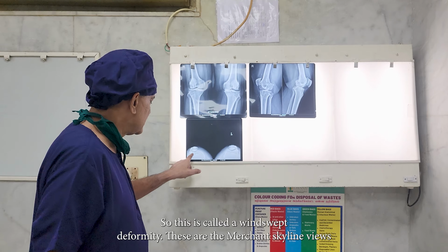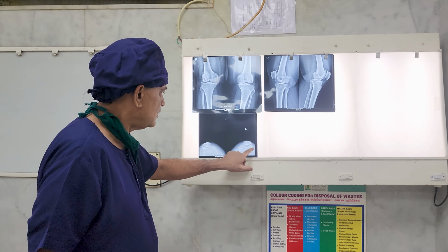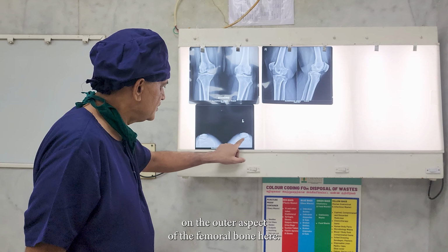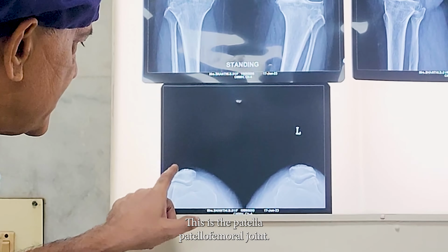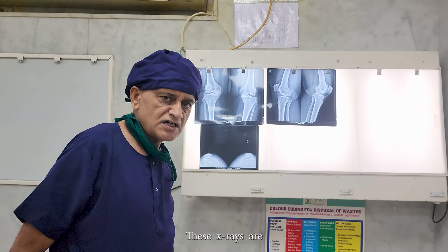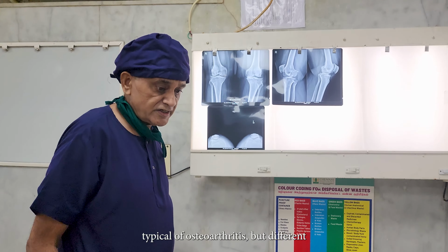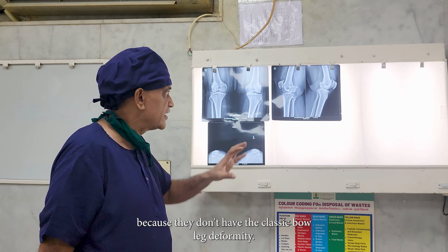These are the Merchant skyline views, and you can see spur formation on the outer aspect of the femoral bone here. This is the patellofemoral joint. These x-rays are typical of osteoarthritis, but different because they don't have the classic bow leg deformity.